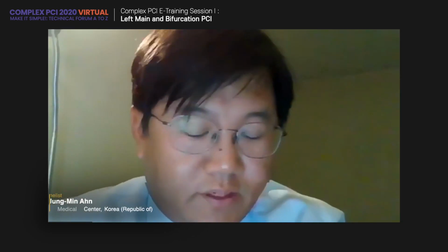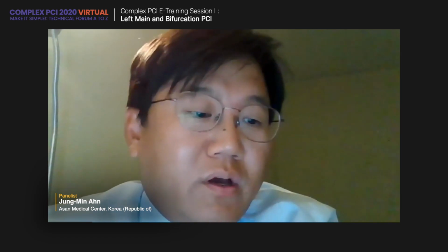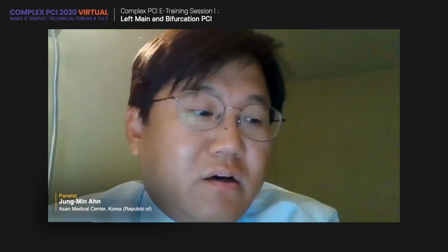Thank you, Dr. Yeung. I think it's a very important question. Actually, we don't have a right answer yet, but that will be one of our future works. We have to define it. But so far, the previous data from Dr. Kang show that after simple crossover stenting, side branch functional jailing, which means FFR less than 0.80, occurred in 7%. There are two criteria to predict the functional jailing. One is the plaque burden, the second is the minimal lumen area. A plaque burden of roughly 50% and a minimum lumen area of roughly 4 square millimeters can predict the functional jailing after simple crossover stenting.